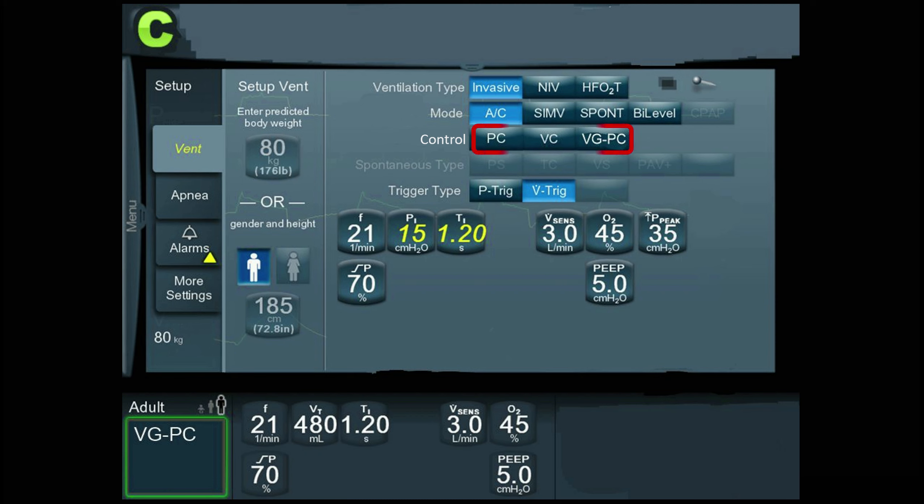On this particular screen, you can see under control there's pressure control, volume control, and volume guaranteed pressure control.